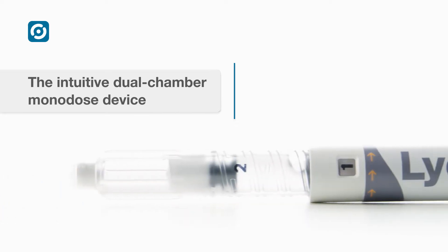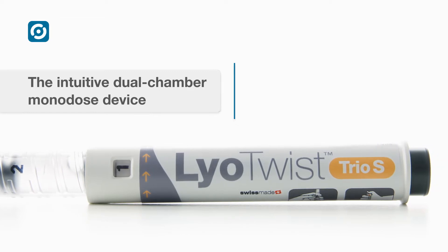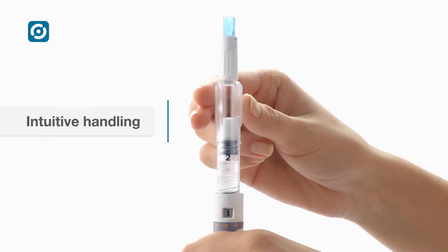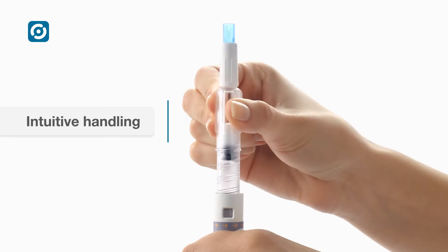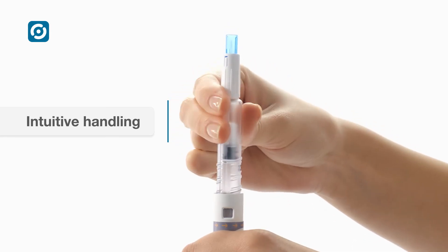LyoTwist is the intuitive solution for simple and safe reconstitution and injection of lyophilized drugs. The LyoTwist device family is based on Ypsomed's patented and proven twisting method for reconstitution and priming.